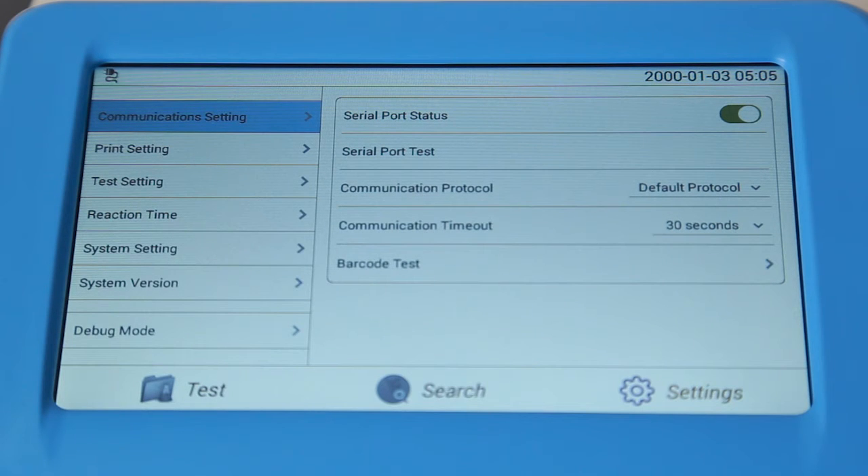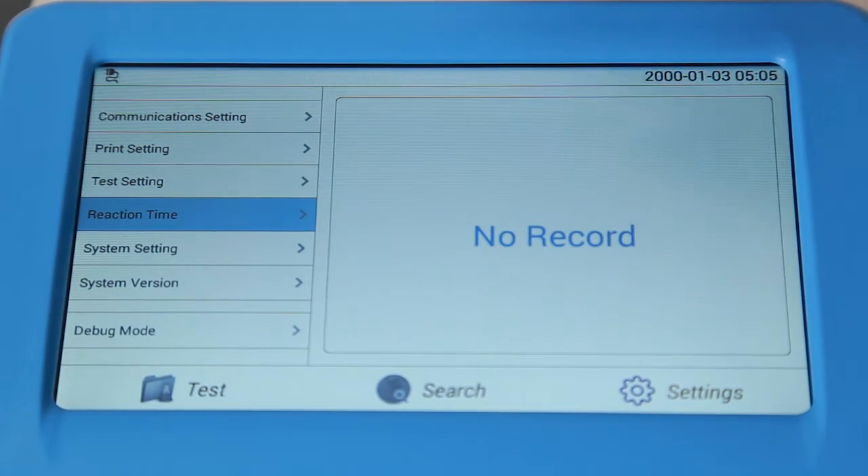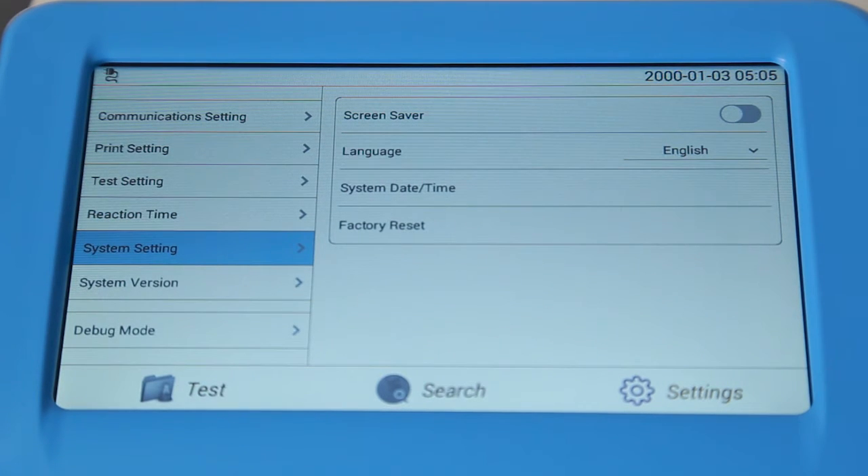Settings of sample and reaction mode can be done on the Test Settings interface. The Reaction Time interface is designed to set the display time of each test item, and is normally set at the factory. The System Setting interface is designed to set screen saver, language, date, time, and restore factory settings.